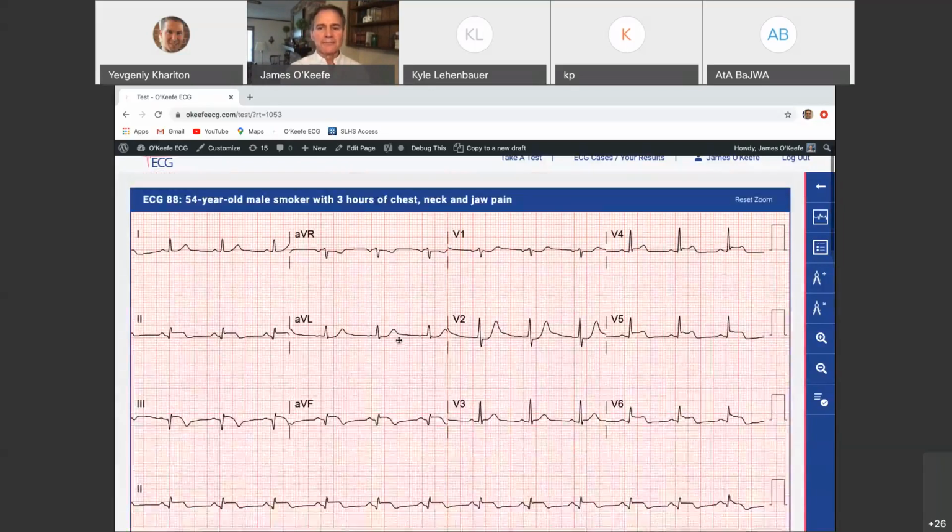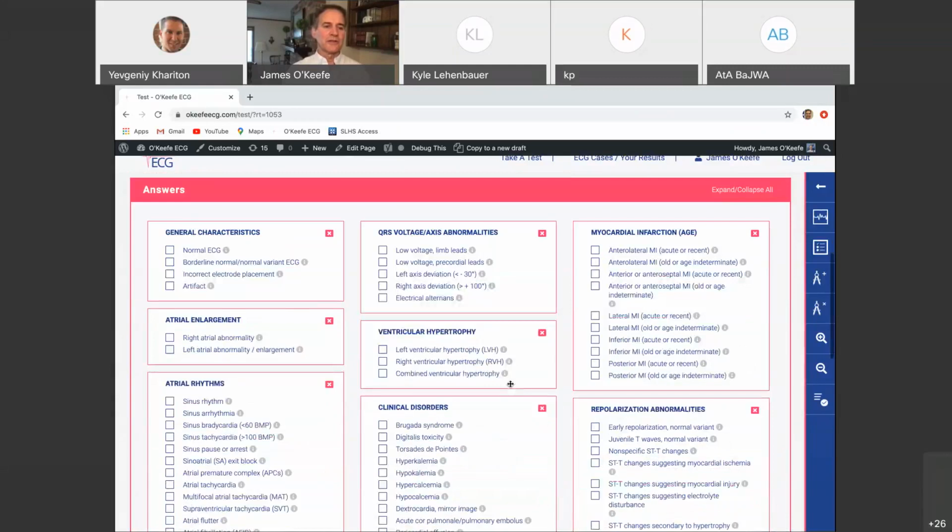So you could say there might be an anterior infarct too, but it's in V4, but it's not in V3. V4 is sort of, you know, it can go either way. It can be counted as an anterior or anterolateral, but you just need two of the three, V4 to V6, to call an anterolateral for the boards, and two contiguous leads in V1 to V4 to call anterior or anteroseptal. So we would call a sinus rhythm with an acute anterolateral and posterior and inferior.